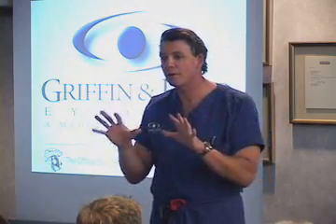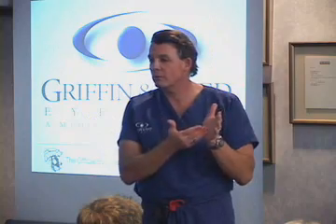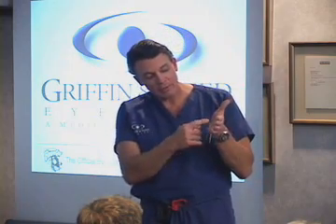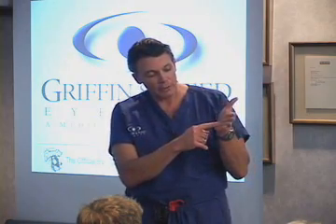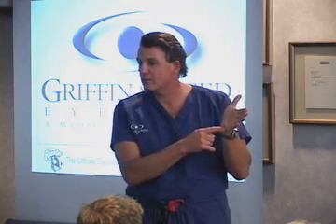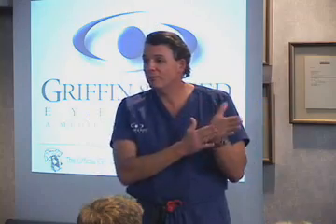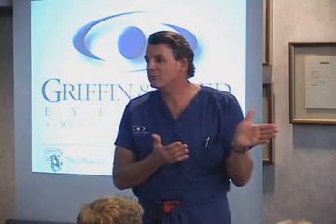We scan everybody for unique imperfections on a wave scan when they come in for surgery, before surgery. And then we sit down with each person and we look it over and we say, this is how much you have, this is the kind that causes night vision problems, this is the kind that causes that. Do you have problems with this? If you have a small percentage of the unique imperfection of your total correction and you don't have problems with that, it makes no sense to do custom.